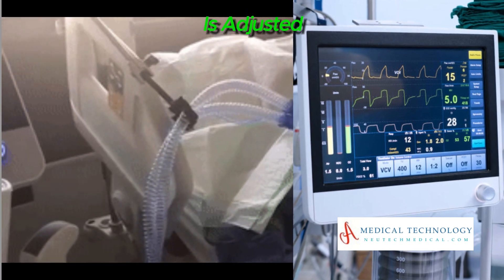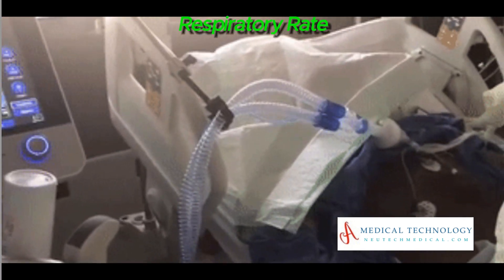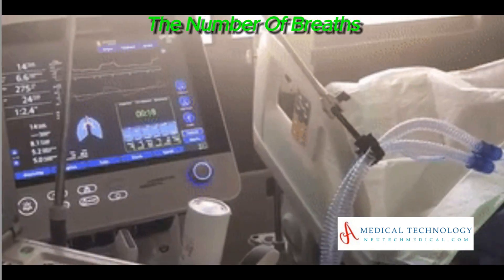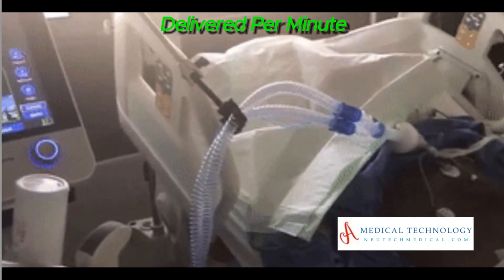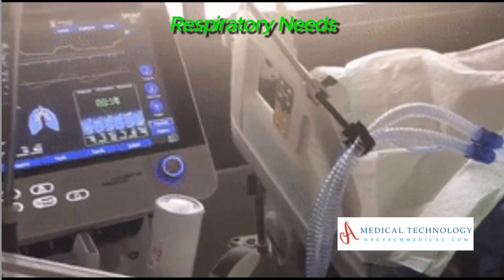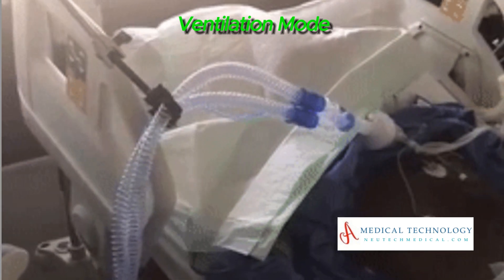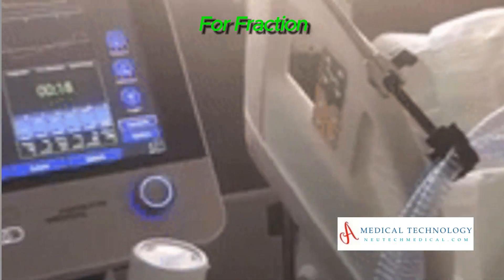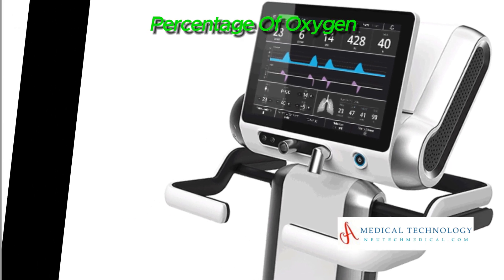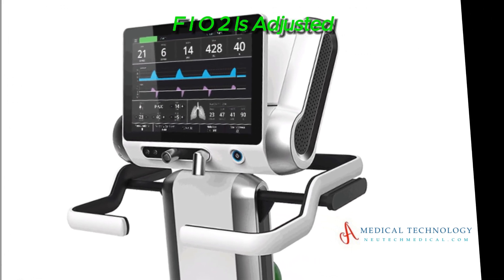Tidal volume is adjusted based on the patient's size and condition. Third, respiratory rate (RR): determine the number of breaths delivered per minute. The respiratory rate is adjusted based on the patient's respiratory needs and the selected ventilation mode.